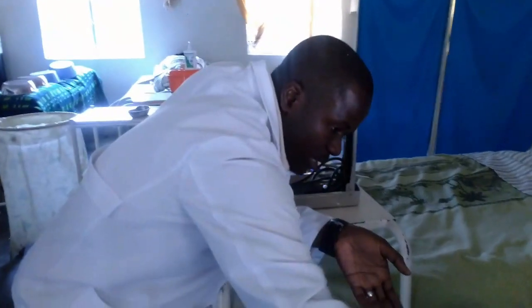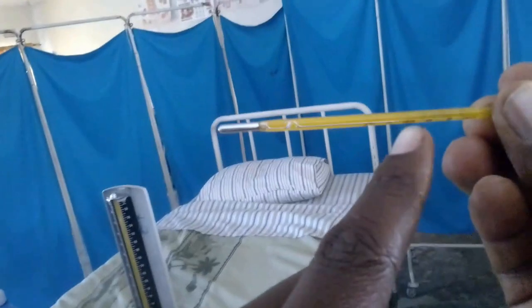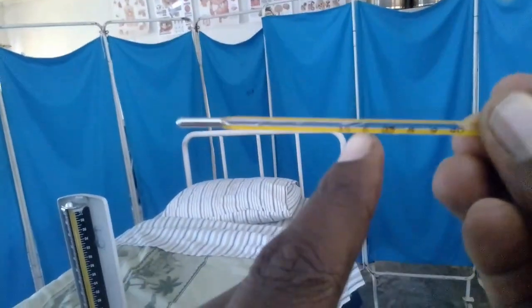After counting the respiratory rate in a minute and the pulse rate in a minute, obviously 3 minutes has passed. So you need to get your thermometer and view it like that. As you can see, that's the mercury, this brown or grayish thing here. That's the mercury here. Okay. So the readings are here. So this is 36.5.